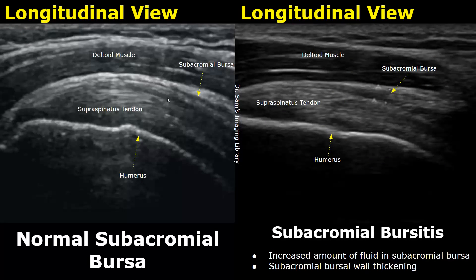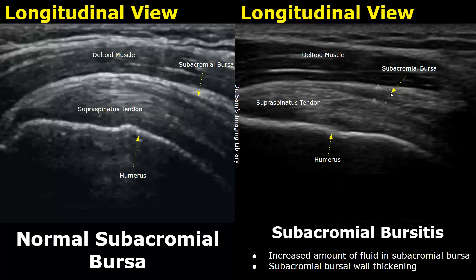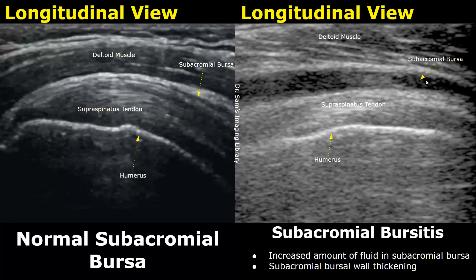A normal subacromial bursa appears as a thin hyperechoic line between the deltoid muscle and the supraspinatus tendon. Here we have subacromial bursitis — there is an increased amount of fluid in the bursa and increased bursal wall thickening. Here is another image of subacromial bursitis showing a very large amount of fluid within the bursa.